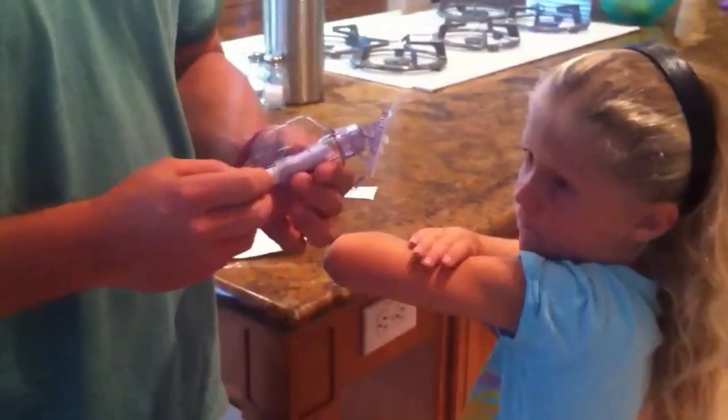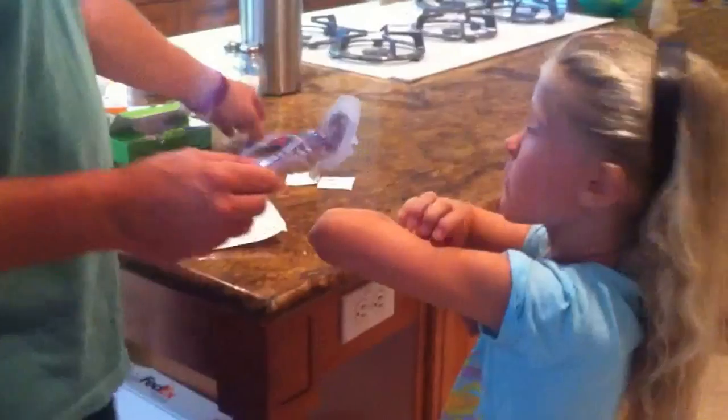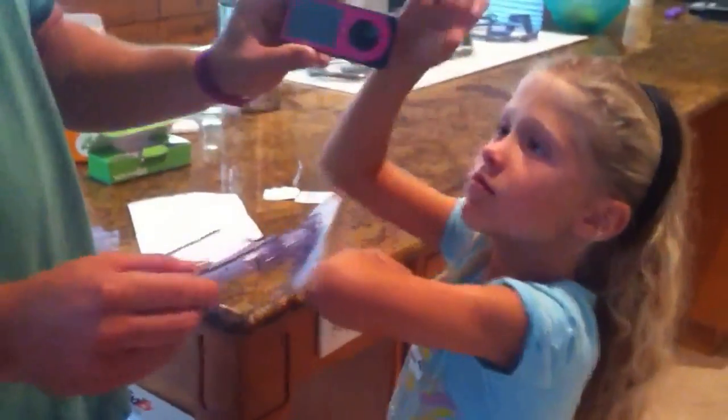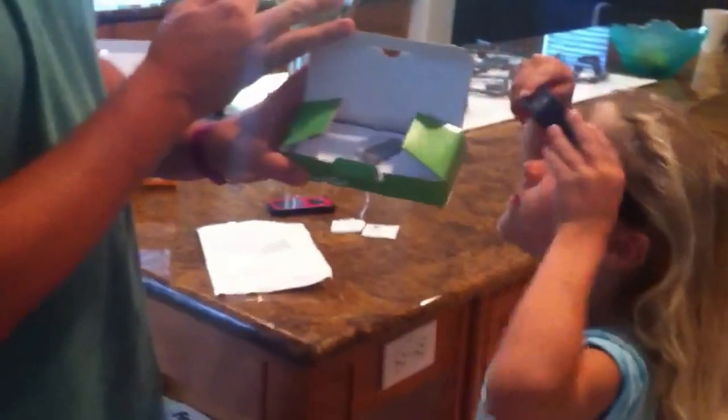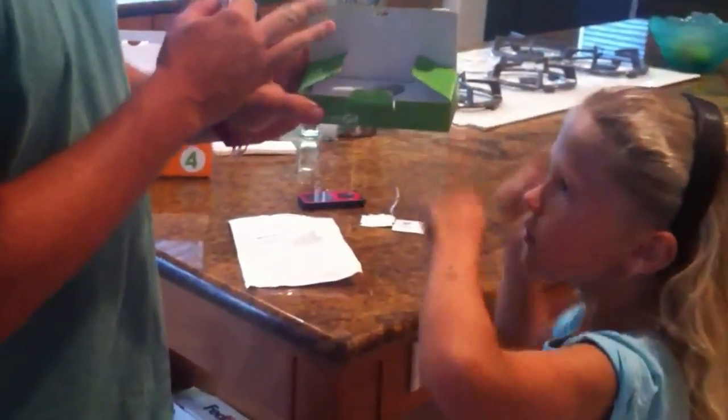So what is this? This is Ella's new Dexcom continuous glucose monitor. It's a wireless monitor hooked up to this sensor, and this transmitter will report her glucose every five minutes.